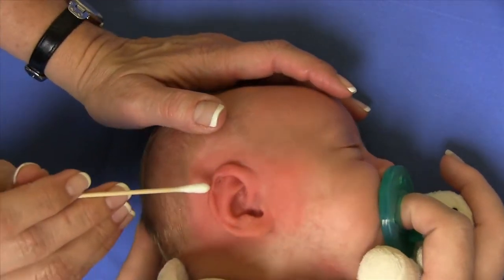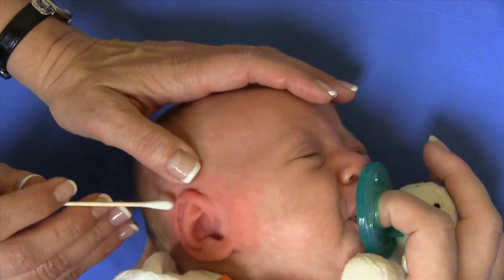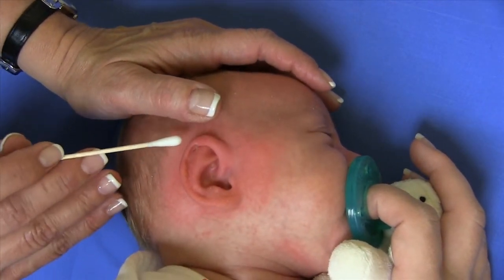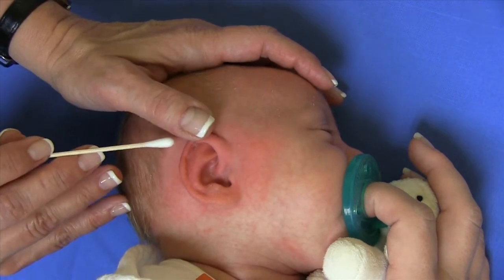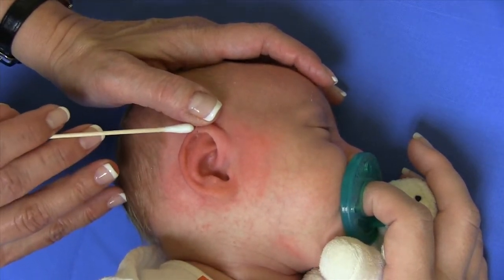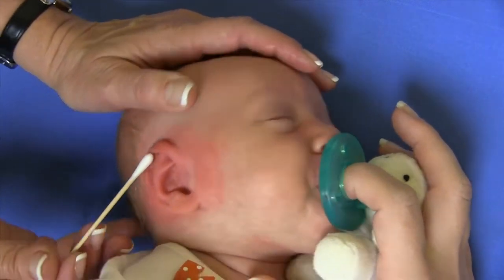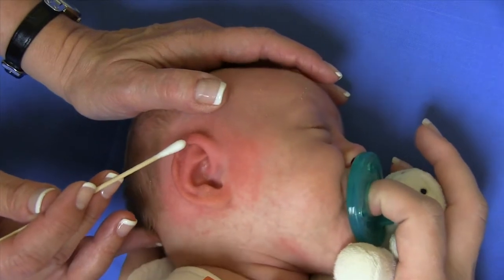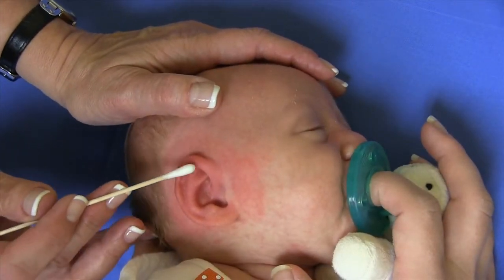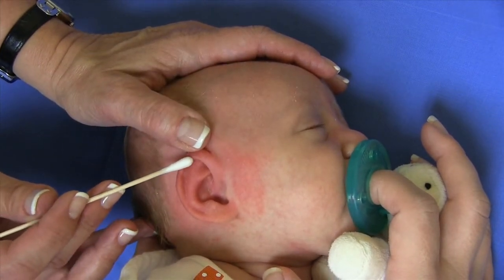I want to lift this last part of the helical rim. What's difficult with this, and what you will find in babies that have helical rim constriction, is that there's a true constriction where if I lift this up, this is actually not folded over — this is continuous tissue here. But what we can do is sneak that retractor up to lift that last little bit of the rim so that it fools the eye and doesn't catch the eye. It looks like we have a little bit of lifting here, when in fact we have just a little bit more constriction.